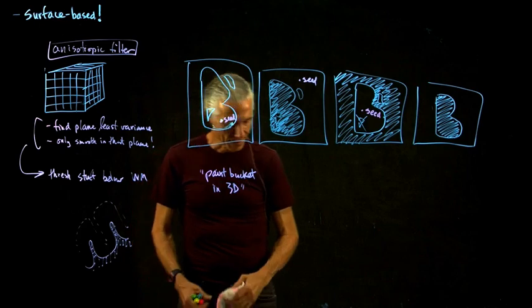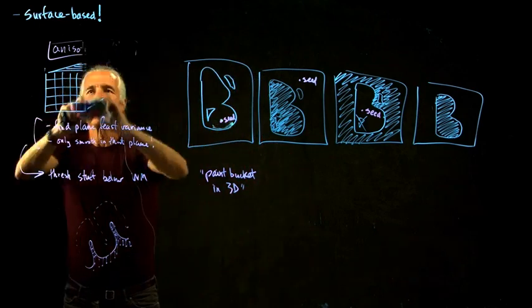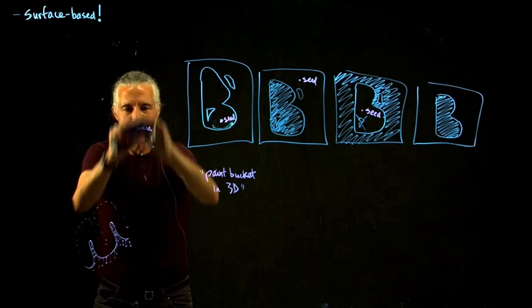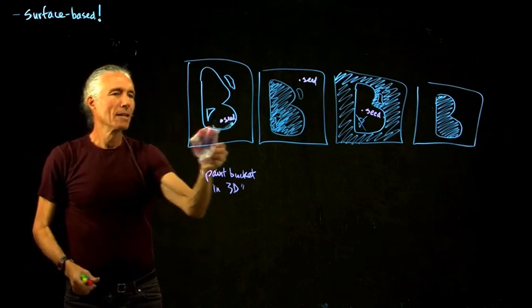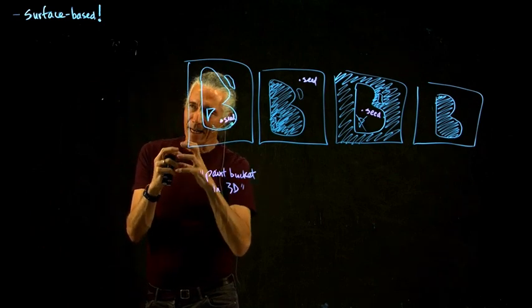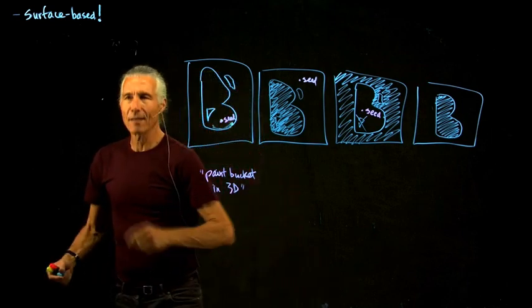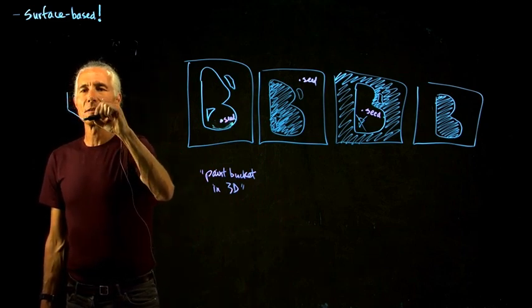We've got a solid block of voxels. And so that's still not a surface. So how do we make a surface out of that? What we have to do is go through that solid block of voxels, which hopefully doesn't have any voids in it. It's just a single simply connected block of voxels, and then we've got to tie it together into a surface. So let me just draw a little chunk of that.